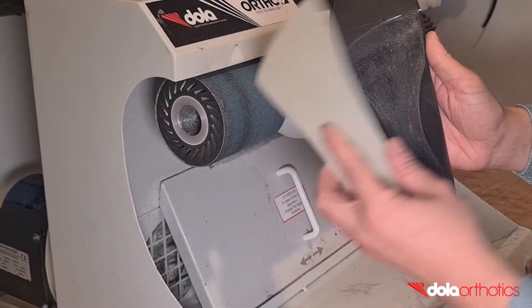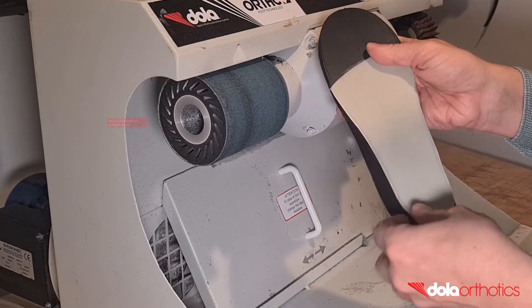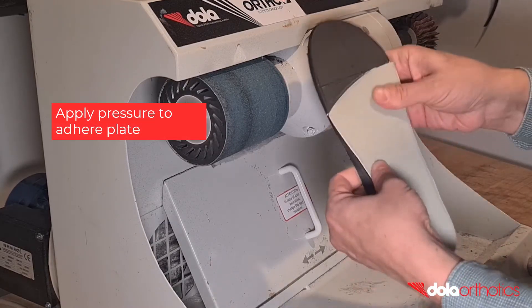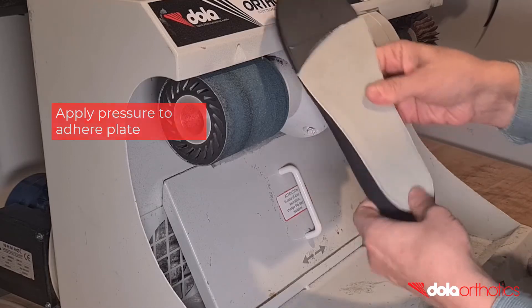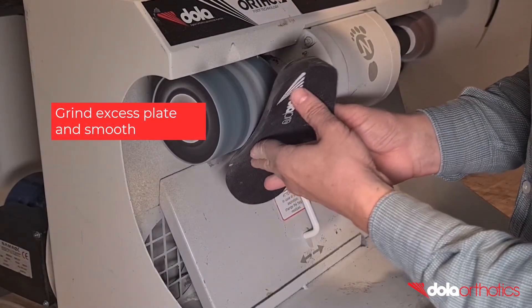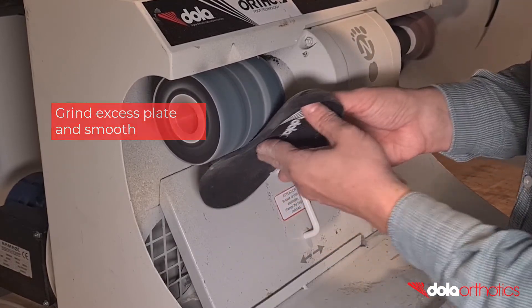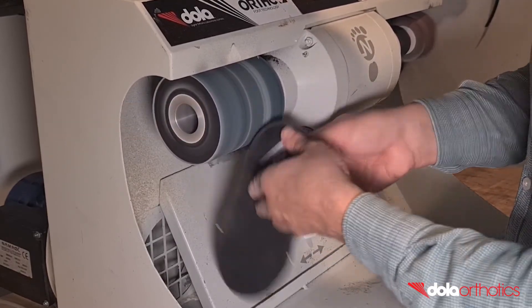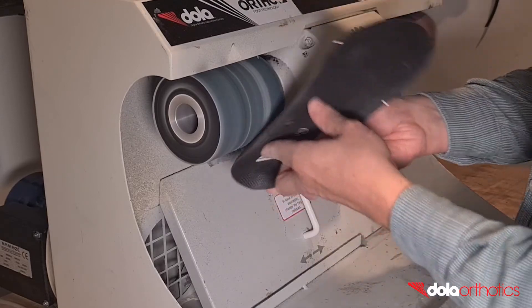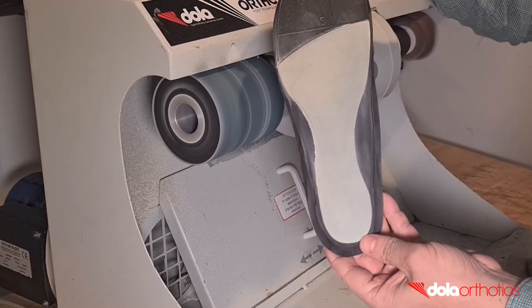Once dry, align the DOLA tech plate with the markings and adhere the two surfaces together. Apply pressure over the entire surface to ensure adhesion. Once dry, complete a finishing grind of the lateral, posterior, and medial borders and taper to follow the plantar surface. Grind small sections at a time until you become comfortable, then finish with a continuous grind for a smooth finish, or use sandpaper.